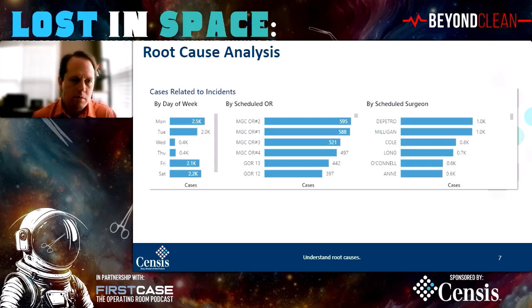One of the things that we discovered that came as a shock to me is that for many hospitals, if you look at the time of day when a case happens where an instrument goes missing, a disproportionate number of those instruments are going missing around lunchtime. Which I thought was really strange, and started asking our customers, what do you think about this? Why is this going on? And a lot of them said, oh yeah, I know what's going on there. That's shift change or lunches, right?